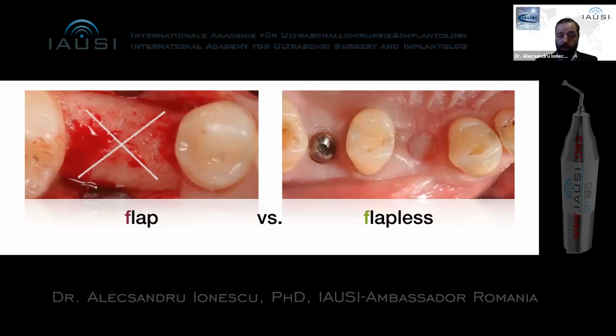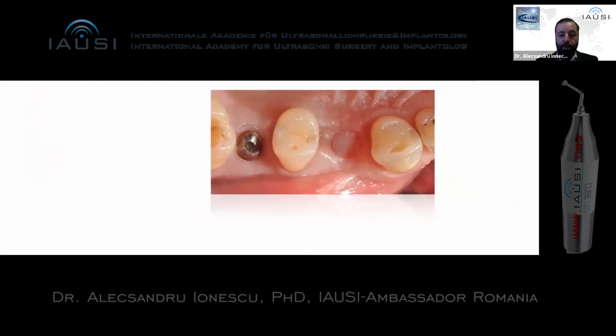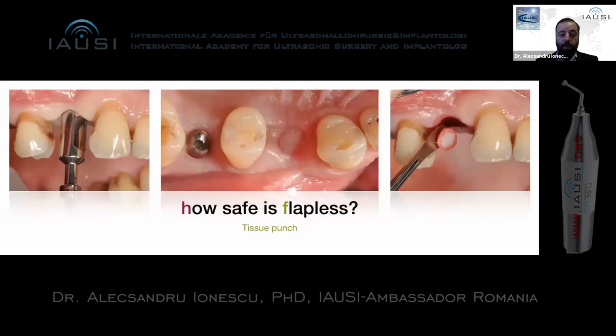So of course we used CBCT scans even at that time, but we had to, let's say, use it in a digital way, like we were using our fingers to feel the ridge, and with one eye looking at the CBCT scan, we were able to, let's say, free guide the drills and the implant. So I'm going to show you another case.